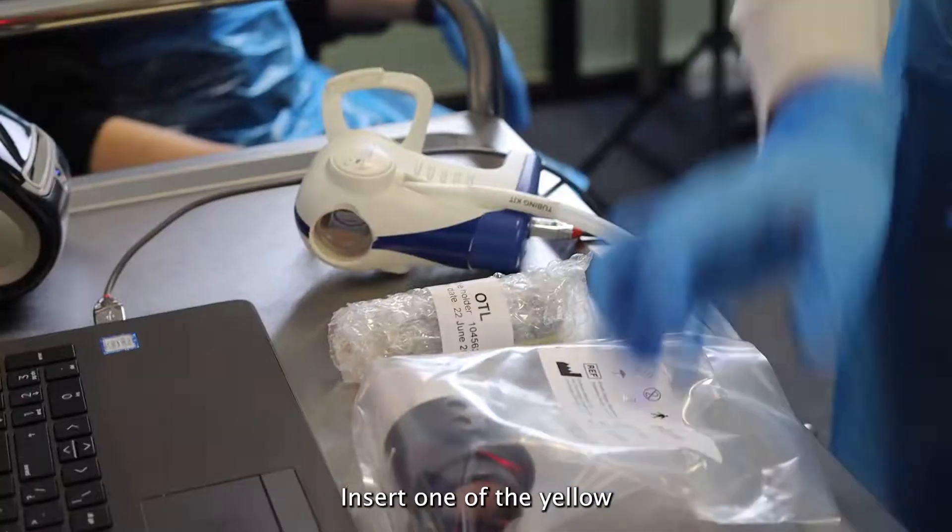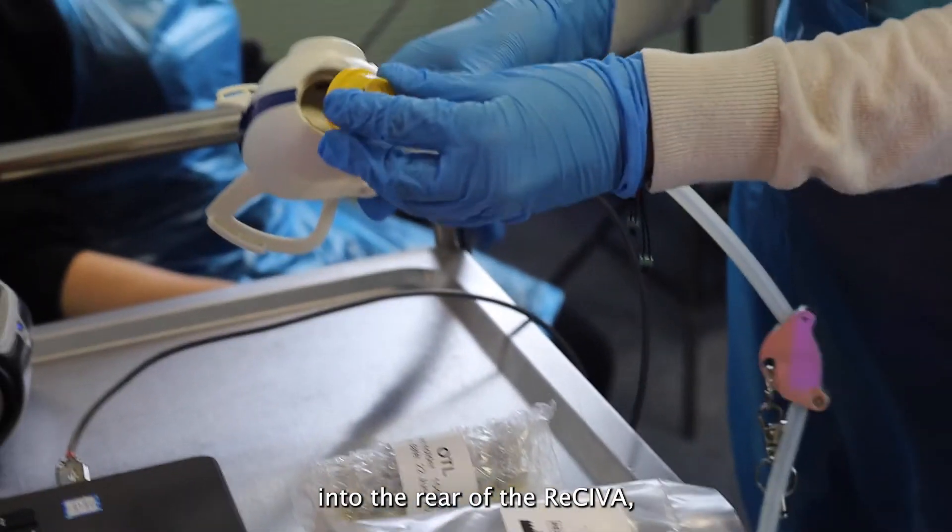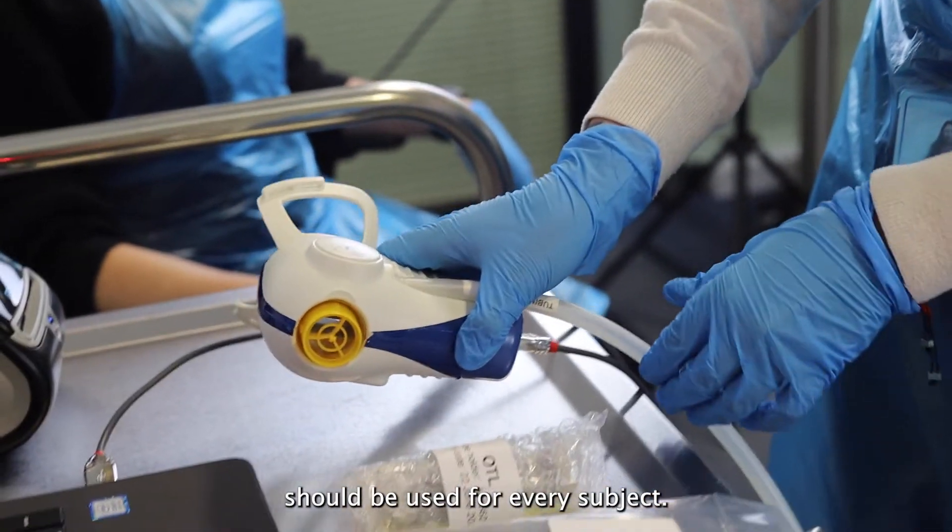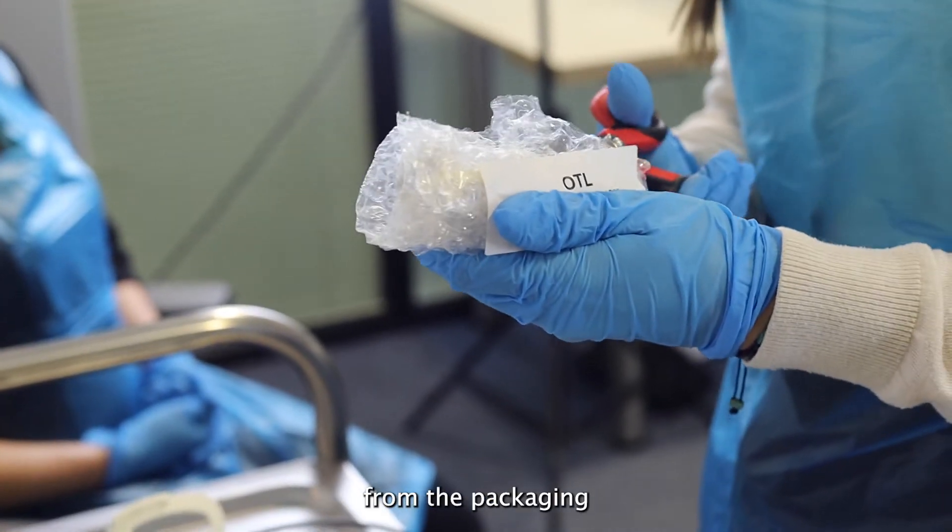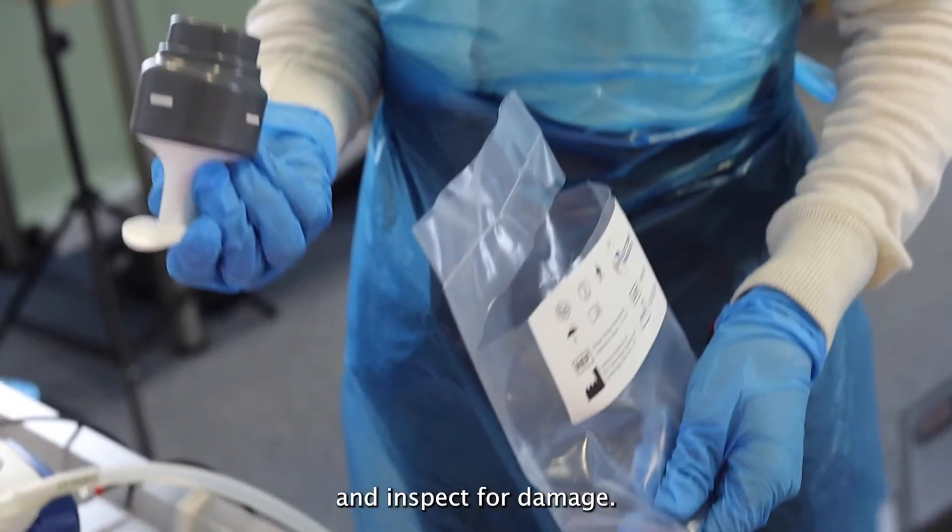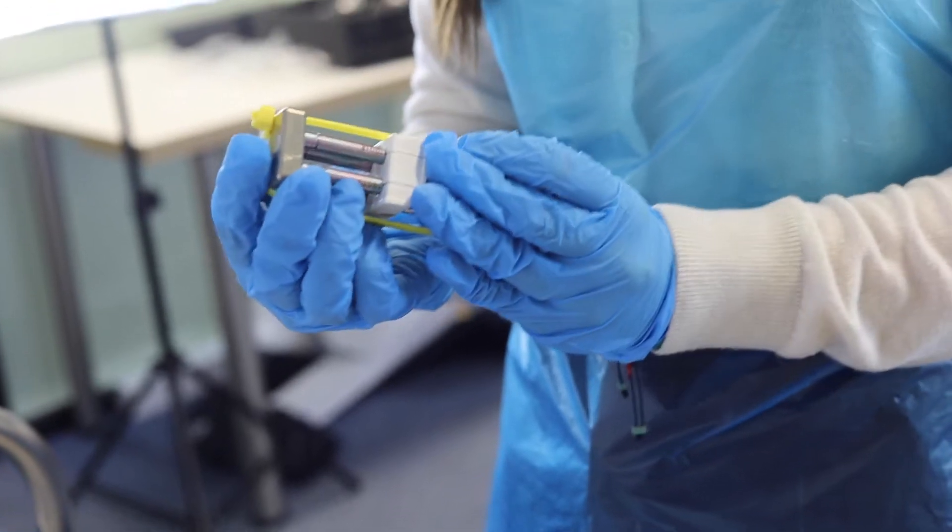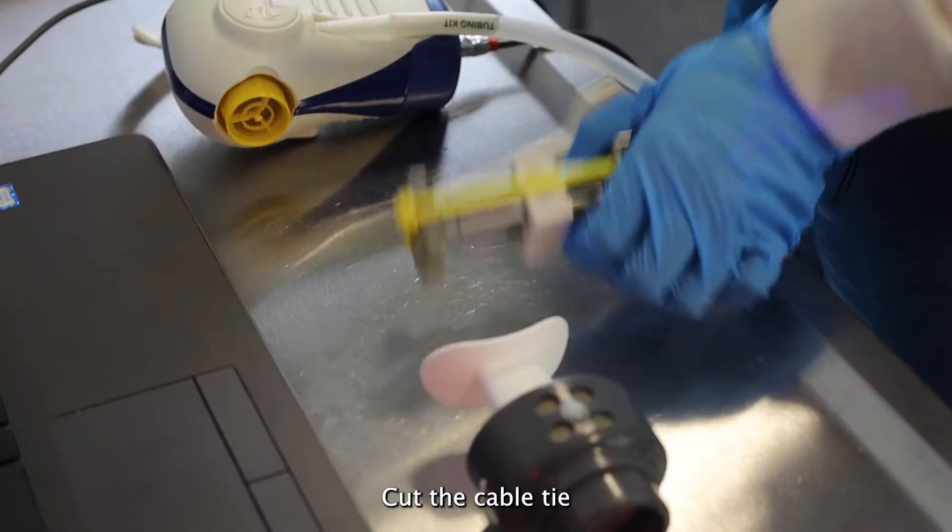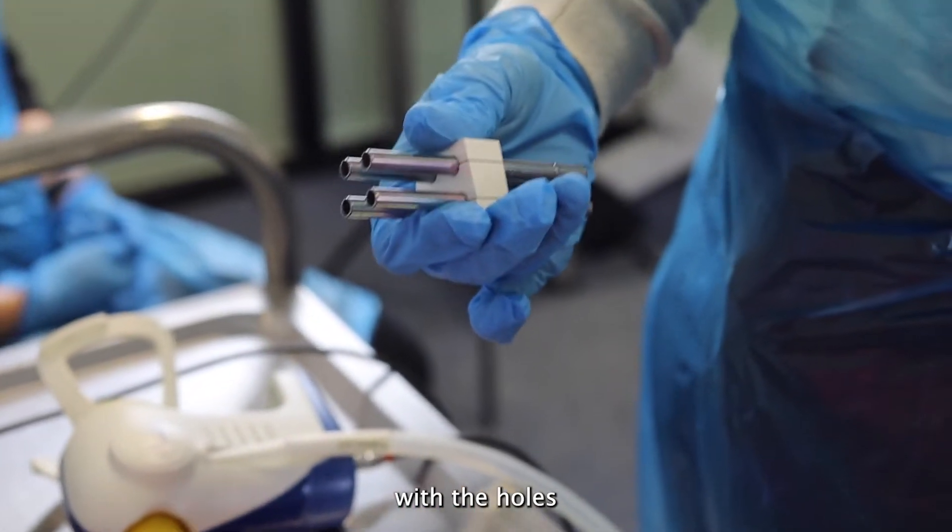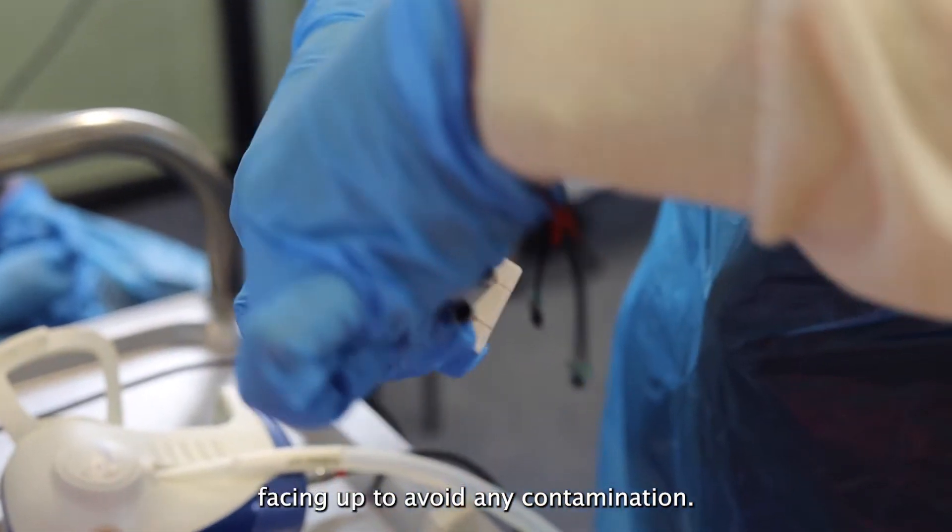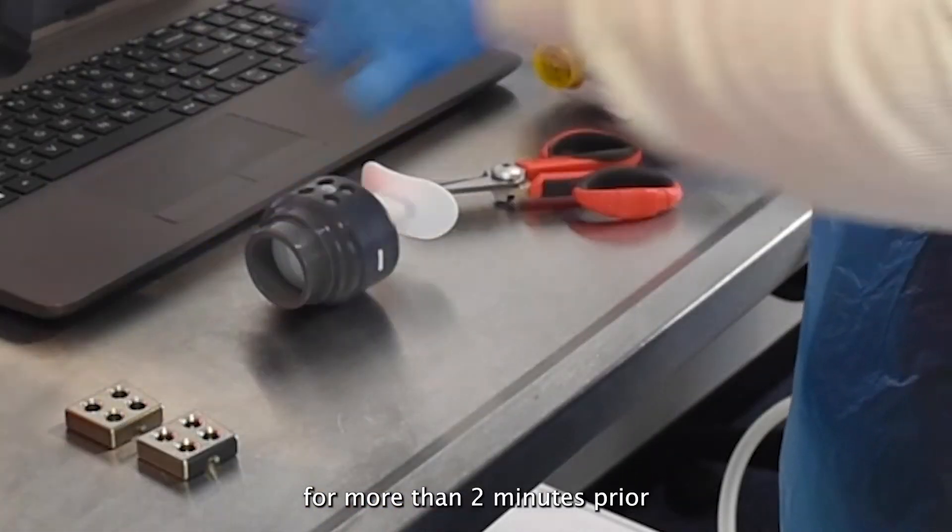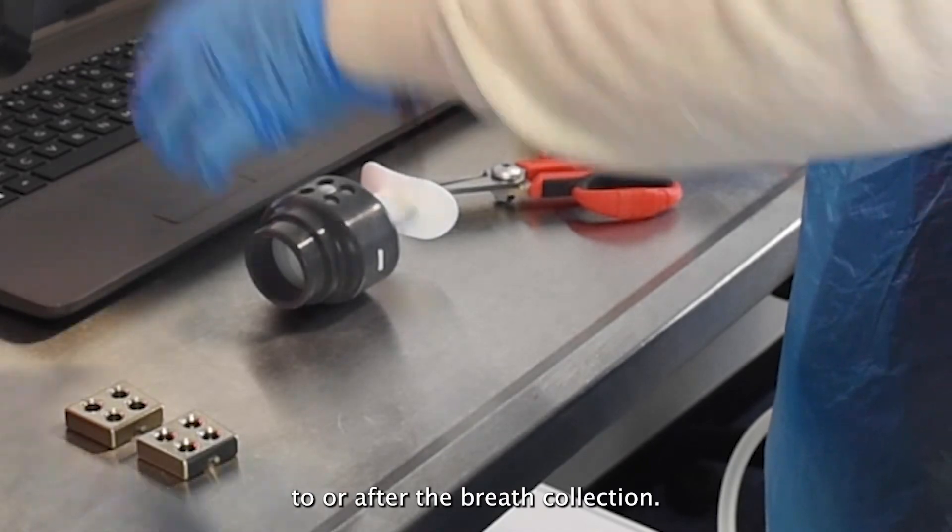Insert one of the yellow non-return valves into the rear of the receiver. A new non-return valve should be used for every subject. Remove the cartridge and mouthpiece from the packaging and inspect for damage. Cut the cable tie and pull the end caps off the cartridge and place on a clean surface with the holes facing up to avoid any contamination. Do not leave the cartridge uncapped for more than two minutes prior to or after the breath collection.